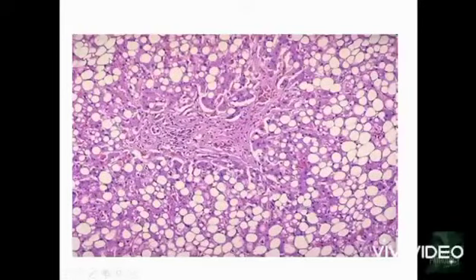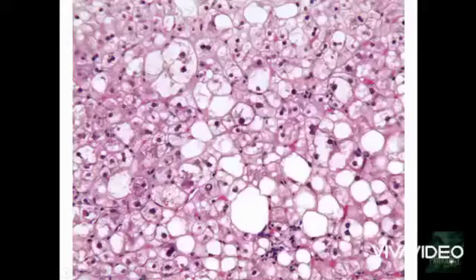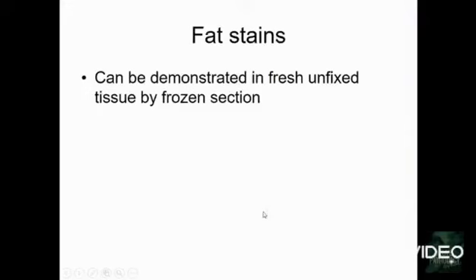Examination, whereas in microscopy, because of the processing, it is appearing clear. Okay, we will know more about how to identify whether this clear space is fat or not. As of now, we just see that these are of various sizes. These smaller ones are microvesicles, and the larger ones are macrovesicles. The same thing, this could be a fatty cyst here.